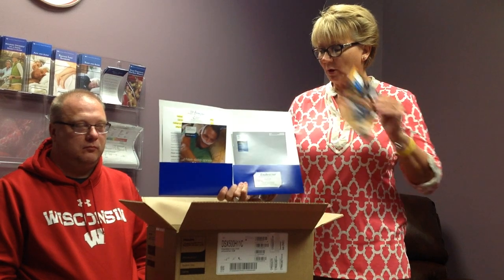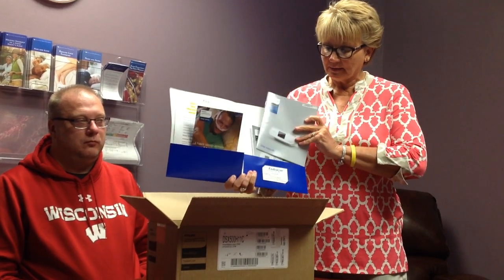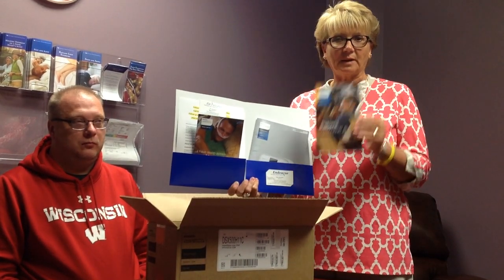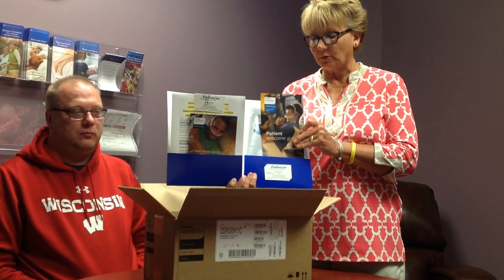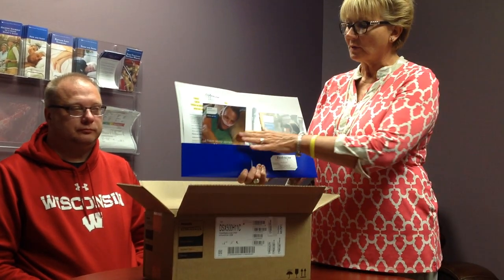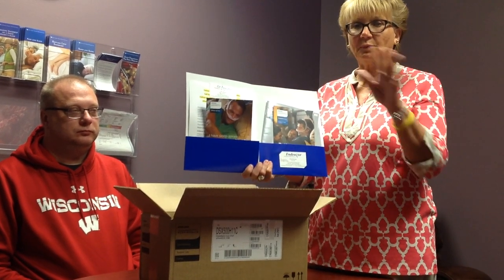Here is the box that you will be receiving. On the top is going to be a folder. Inside this folder is going to be your manual for the machine, manual for the humidifier, and a quick reference guide for the most important points on how to use the machine so you don't have to look through your whole manual. Also in this folder is a little bit about sleep apnea, which you've been diagnosed with, and you're going to be hooked up with Dream Mapper, which we will get into later.